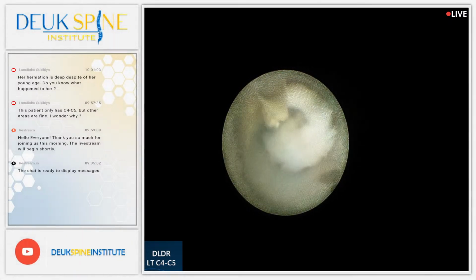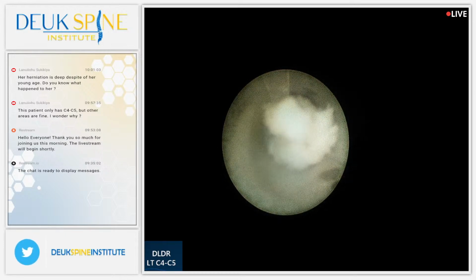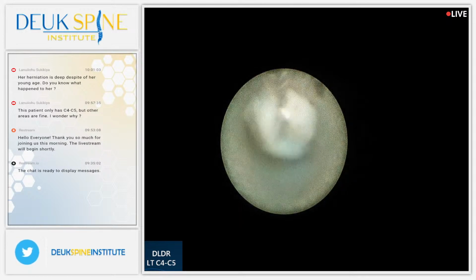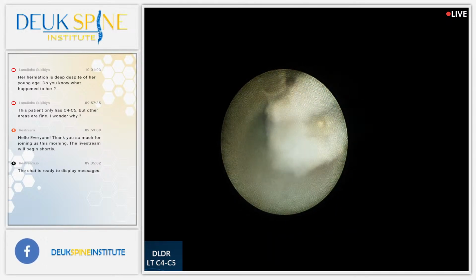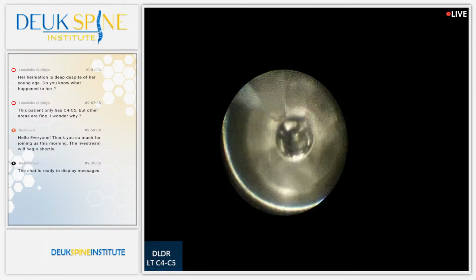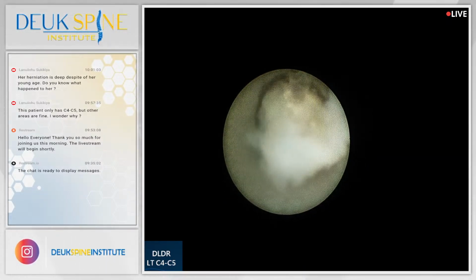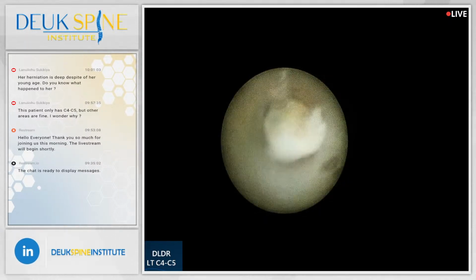There's definitely something happening. Right? It's 550. The box. It's on the second. For those of you who are wondering how, you don't feel it. For those of you who, it's new? This one is a new one, but we used this before. All right, well, let's just see. That's better right there, so let's keep an eye on it.